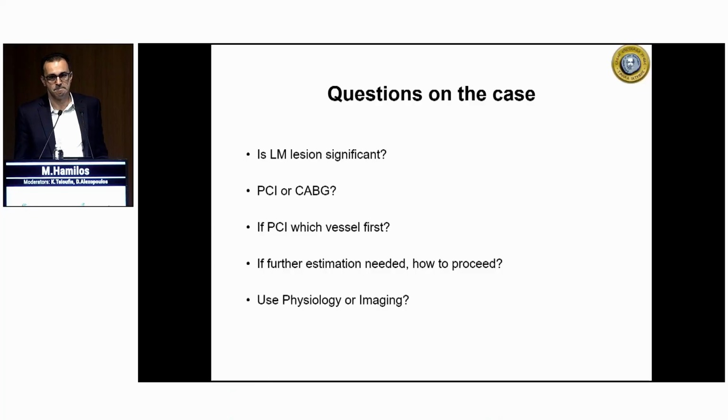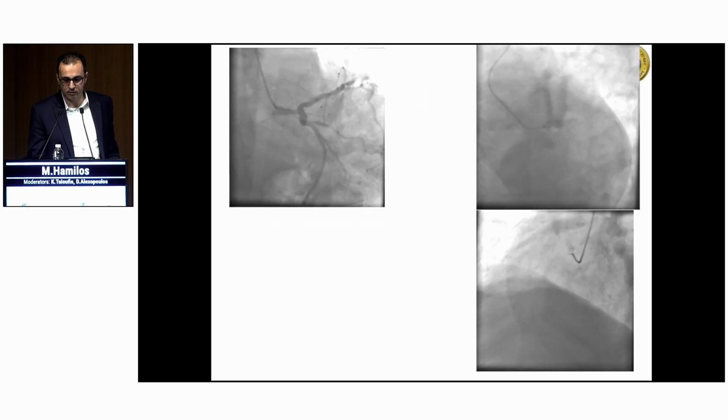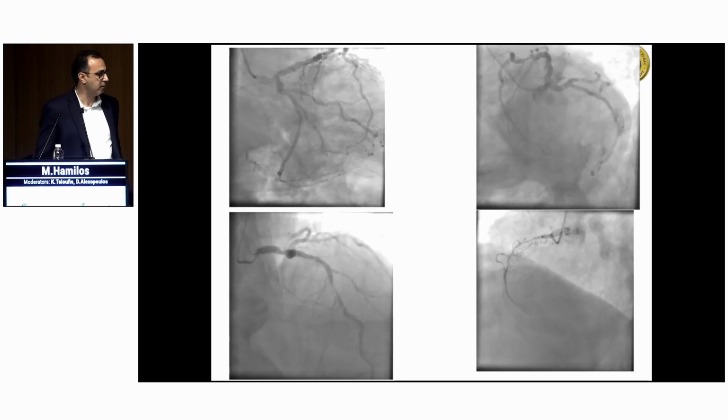Let's let the angiogram play for the control room. Can we go back to see the angio? And is he diabetic? No, he's not diabetic. He's hypertensive, has had an episode of atrial fibrillation, and he's on anticoagulants, apixaban. Do you want the still images or the angio? The angio is better.